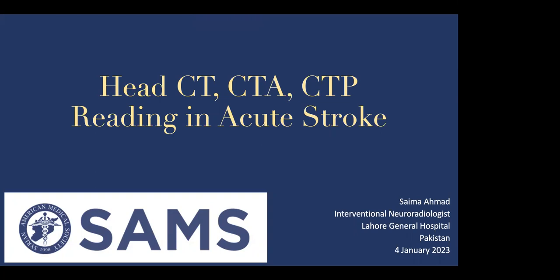Today, our lecture is about head CT, CTA, CTP reading in acute stroke.